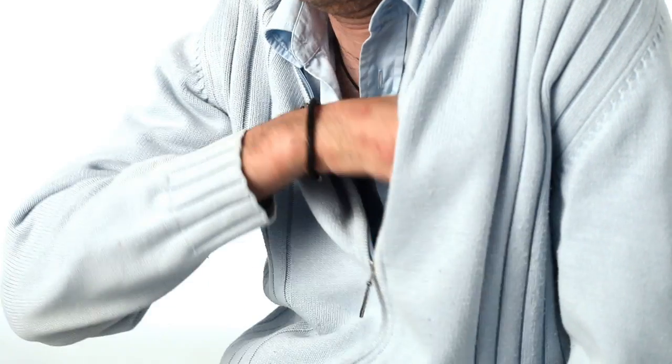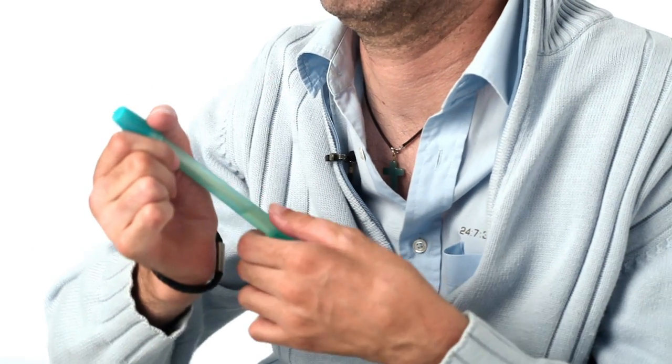I brought one with me and I have it here in my pocket. Very discreet as you can see, very small.